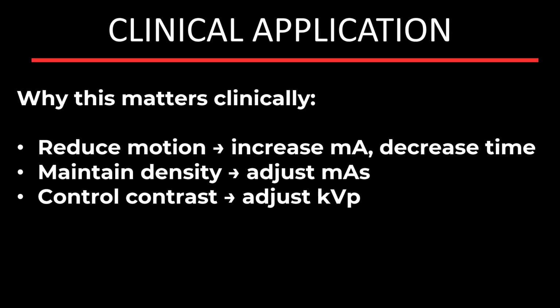The clinical application, and why this matters: if you need to reduce motion, increase mA and decrease time. Maintain density, adjust the mAs. Control contrast, adjust the kVp. In real practice, these adjustments help optimize image quality while minimizing patient dose and motion artifact.